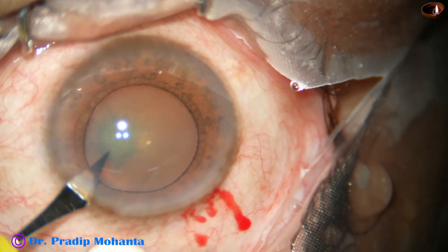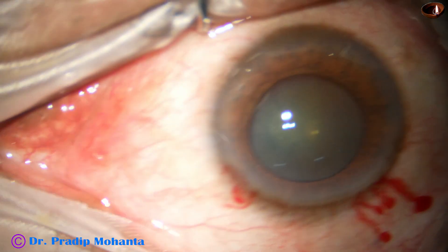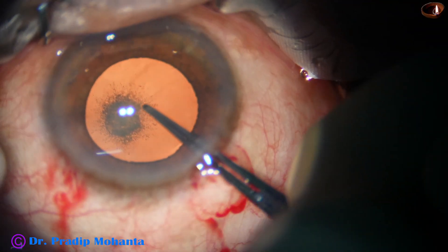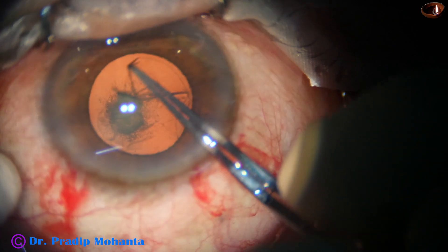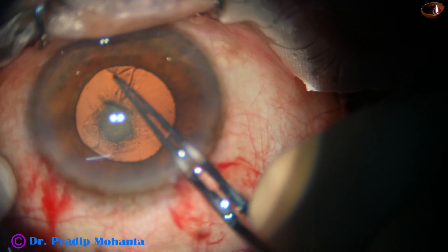A side port is then made on the left side of the main incision. I go to the coaxial illumination and perform capsulorrhexis. The microscope is Lumera T from Zeiss, and the phacoemulsification machine is the Oertli Cataracts 3.